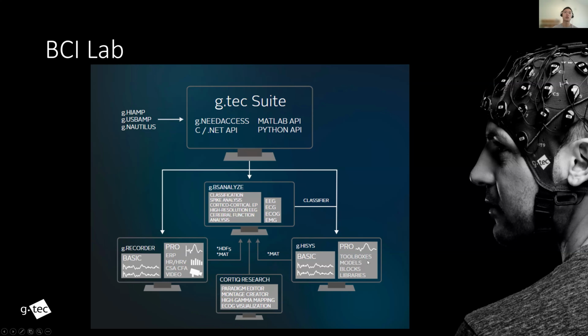There are different toolboxes there allowing you to combine the system with the EEG system, either through hardware trigger, LSL layer online, or different forms of, let's say, Arduino or trigger box. So for complex integration, we recommend doing it through g.HIsys. But of course, if you are a master in Python, then you can integrate everything by using your own code. But it'll be more time consuming and just not as rapid as the g.HIsys model.